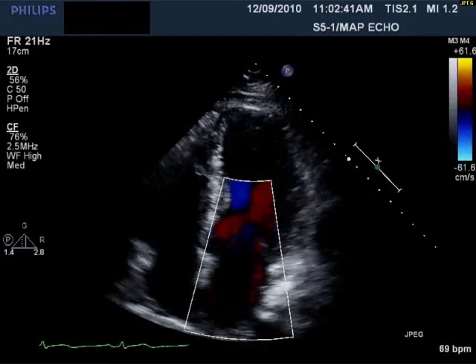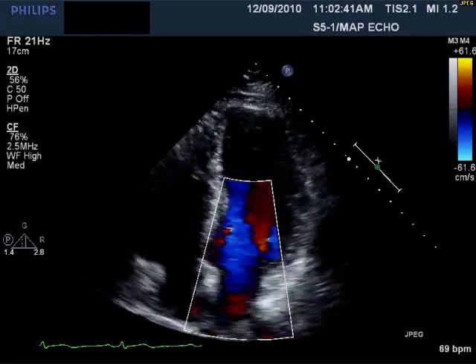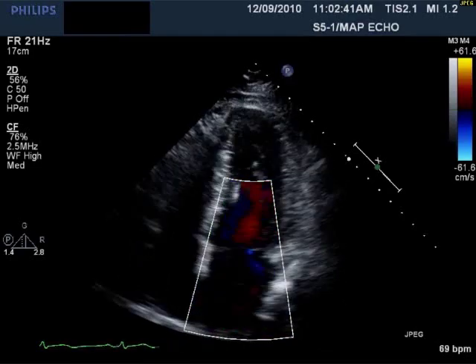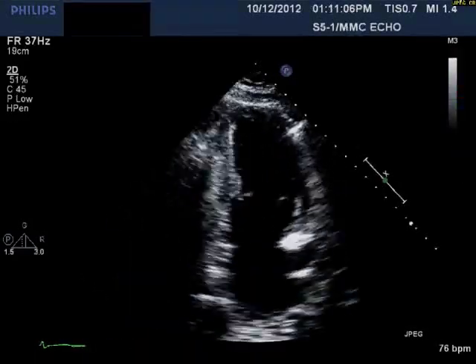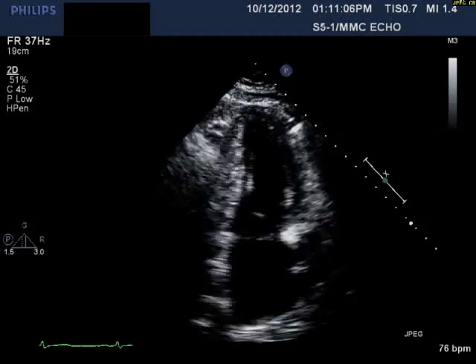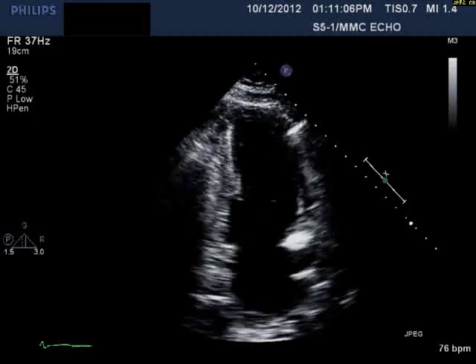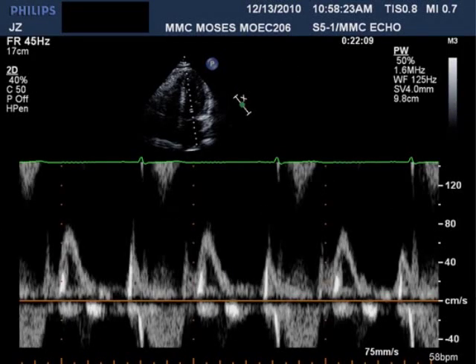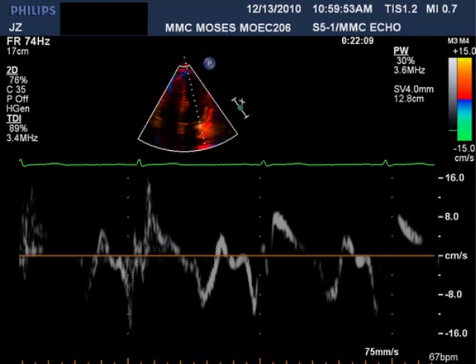Here is an apical 4-chamber with color Doppler — take a look at that. I've also provided an apical 2-chamber view, and I'm showing you pulse wave Doppler through the mitral valve. In the following slide you can see a tissue Doppler of the lateral mitral annulus. Note that the peak e-prime velocity is more than 8 centimeters per second.